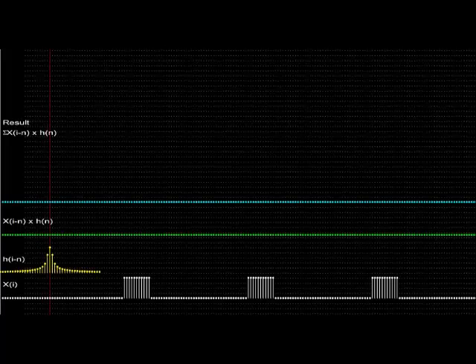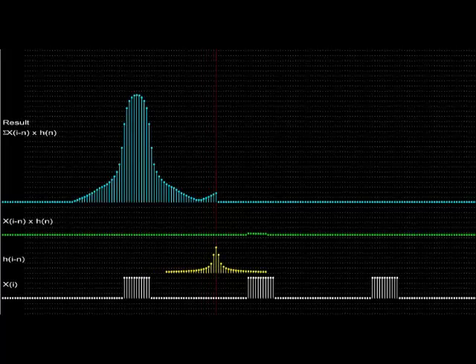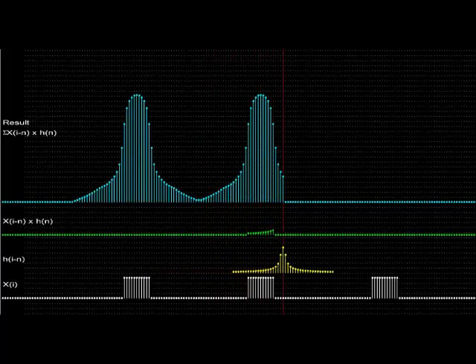This shows the convolution with rectangular pulses by exactly the same process. These pulses are equivalent to an area of uniform intensity in the image, and the output shows how the process of back projection modifies them.